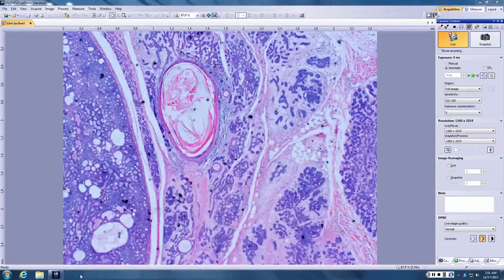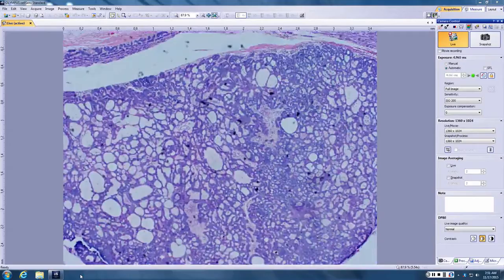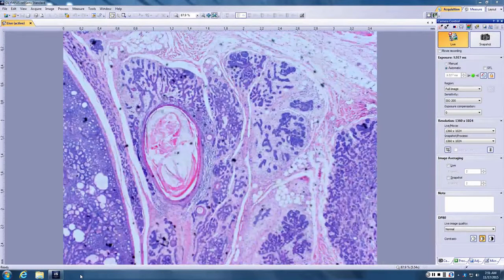So pink strands, blue buds, horn cysts is infundibulocystic BCC, and here it's just grown up to adenoid BCC. So nodule of adenoid BCC, pink strands, blue buds of infundibulocystic BCC. Remember, uncommon or less common variants of very common things tend to be good discriminators.